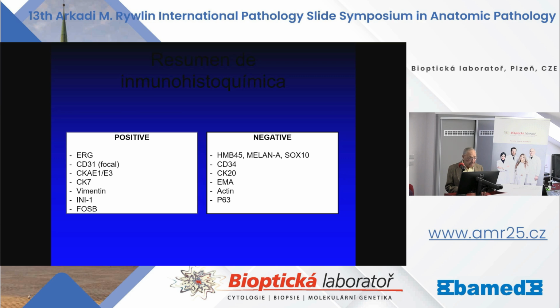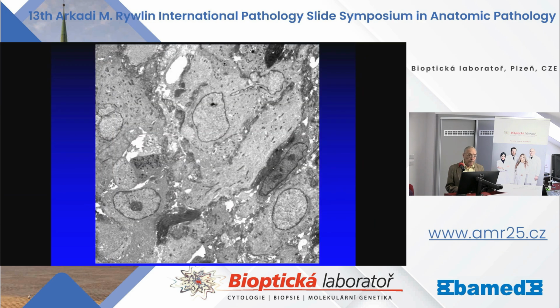We did electron microscopy. This electron microscopy is taken from the paraffin blocks. We use this all the time in Mexico. We have found that as long as the tissue is well preserved and well fixed, you can make electron microscopy with good confidence.